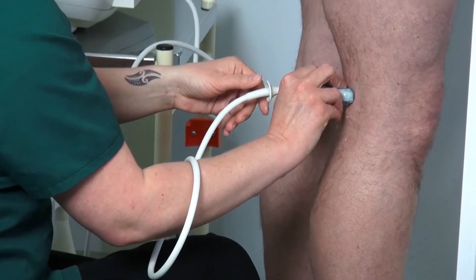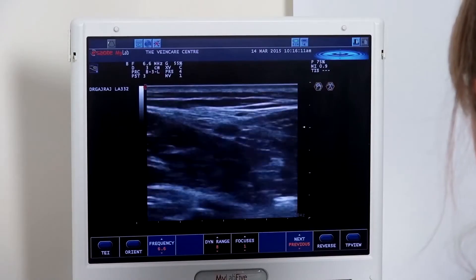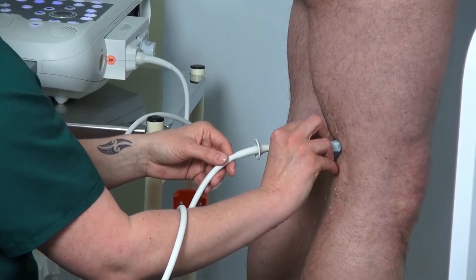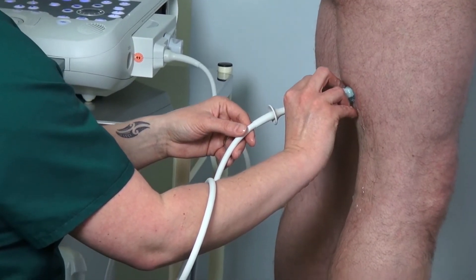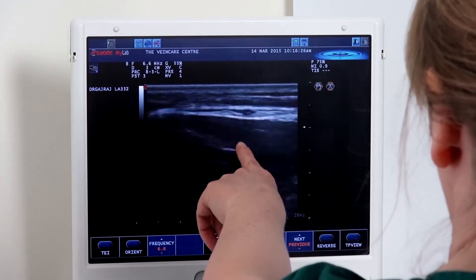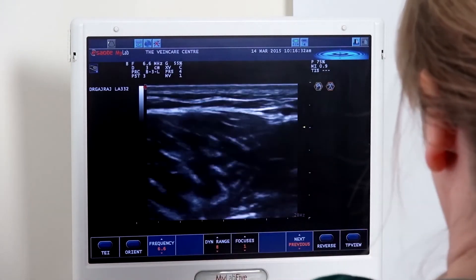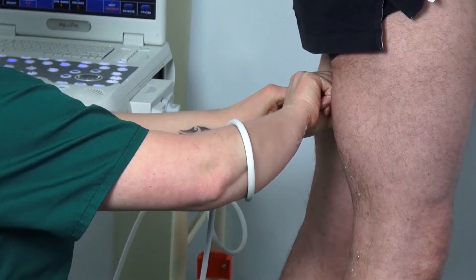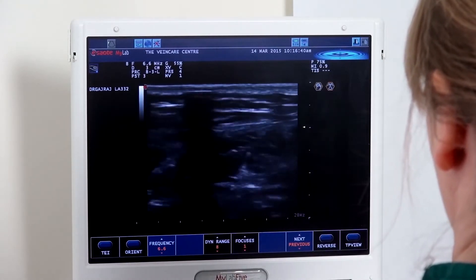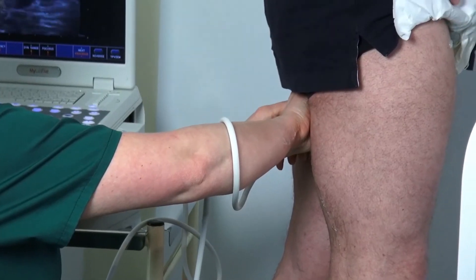Assessing the short saphenous vein — there is quite a lot of variation as to the level of the junction with the popliteal vein. For this gentleman, there isn't actually a saphenopopliteal junction. It's called the Giacomini variant, and we can follow the short saphenous vein right the way up the thigh where it eventually meets the great saphenous vein.